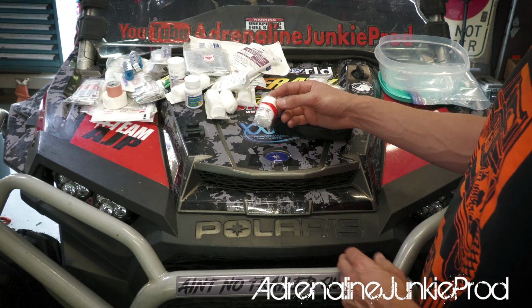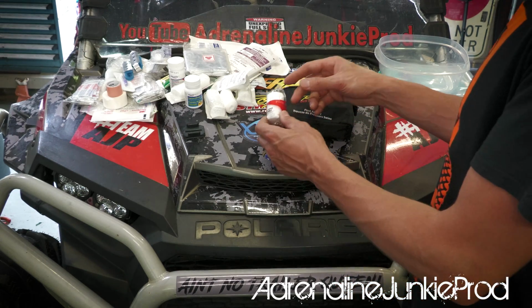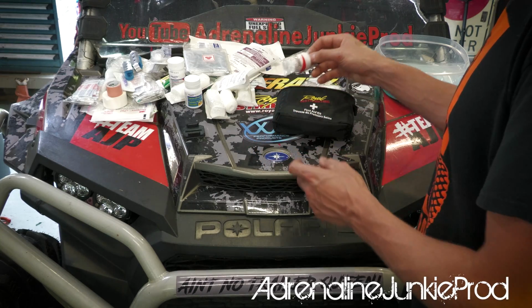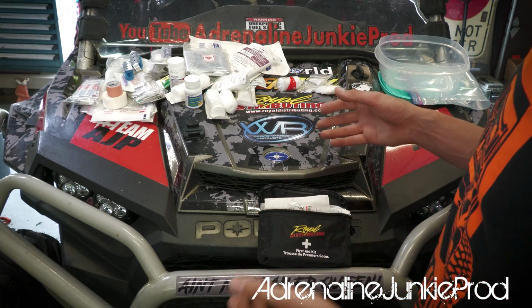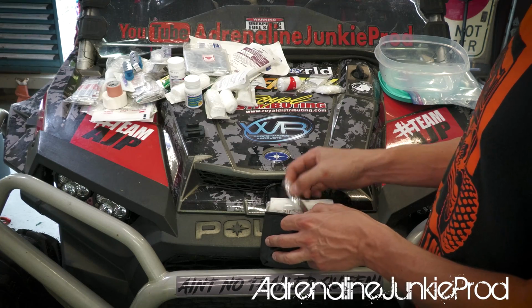This is, like I said earlier, where these kits are lacking. Gauze takes up quite a bit of space, actually. So this is all this kit comes with, is one of these 4.5 meter sections of gauze. I would say that you probably need more, but that will get you through a bind. You can make a dressing out of a sock, you can make a dressing out of a shirt, you can get creative anyway, so no big deal.